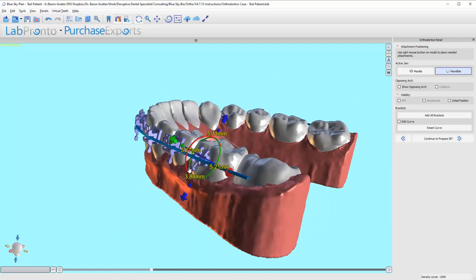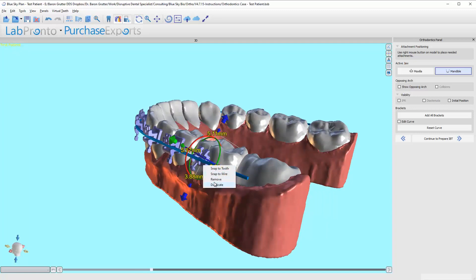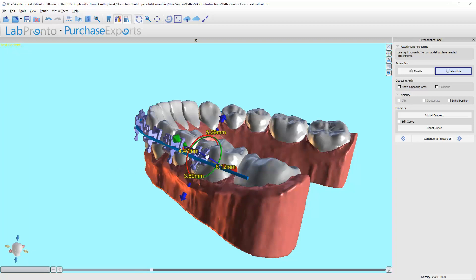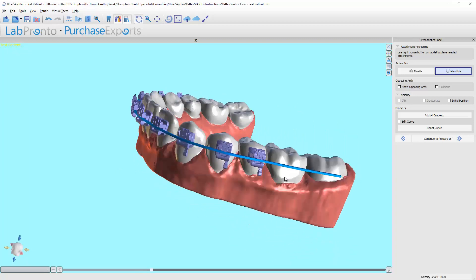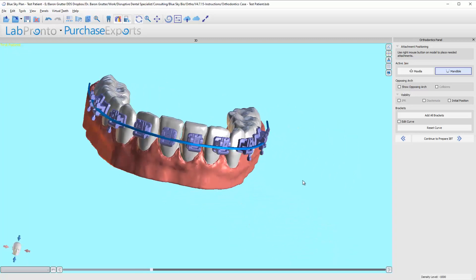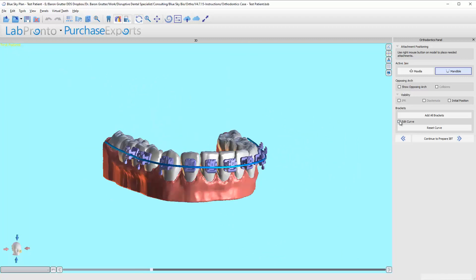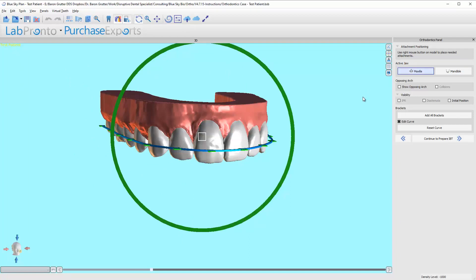You can snap it to the tooth, which is a little bit funky. I wouldn't mess with that right now. But anyway, for now that's the point. I recommend just adding them all at once, but you can go ahead and add them individually if you wanted to for some reason. So now I just need to go to the maxilla and add the brackets there.